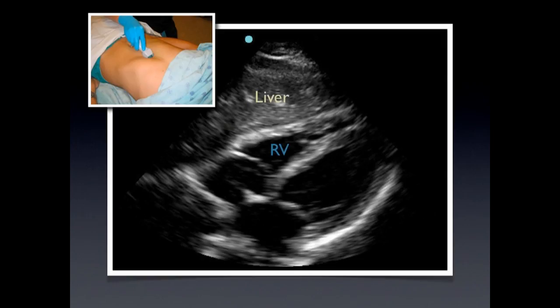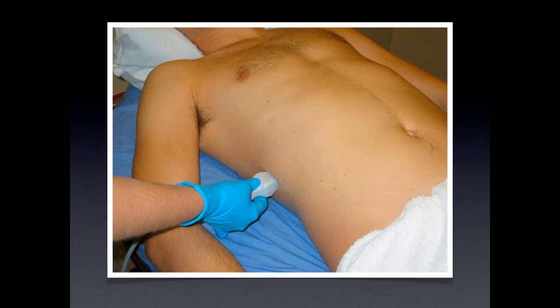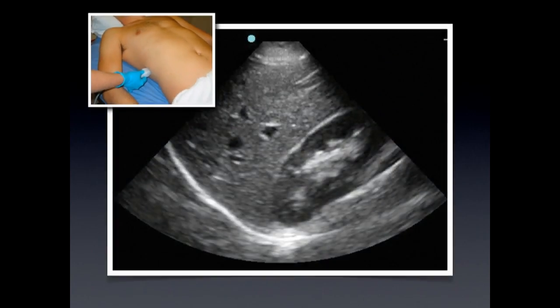At the sub-xiphoid window, we look for the heart — you have the liver, the right side of the heart, the left side of the heart, and the inferior portion of your screen. Then at the right upper quadrant, you're looking at the hepatorenal space, which is the most dependent portion of the body when you're supine and can accumulate fluid. You're looking for the liver, kidney, and you'll be able to see the diaphragm.